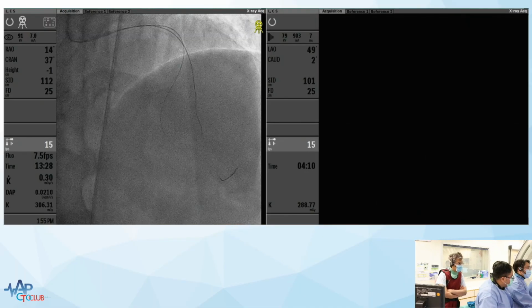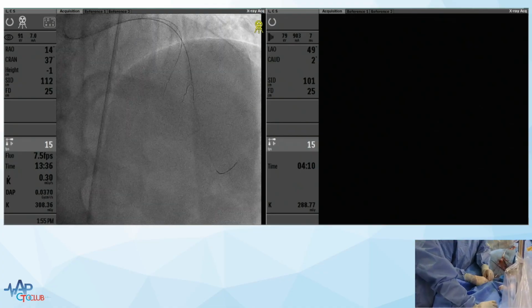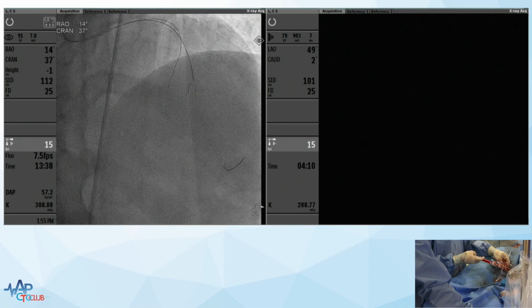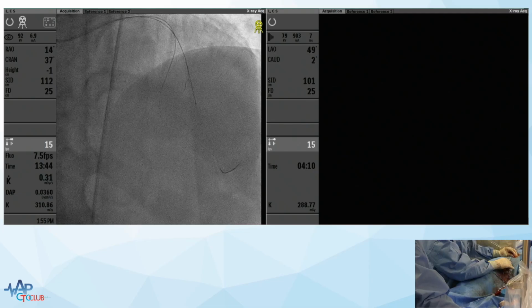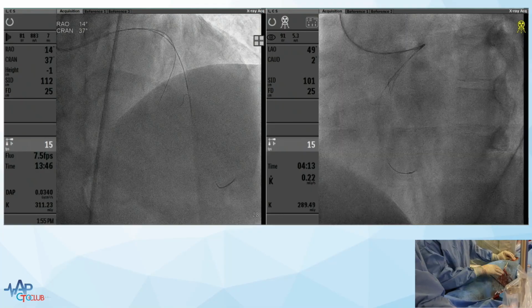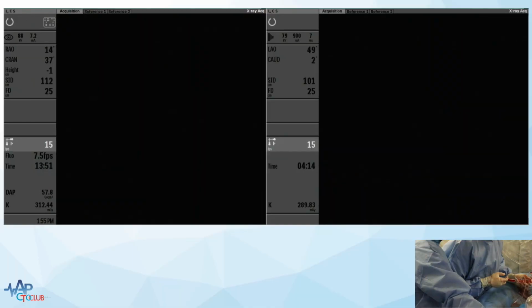But I think Karl has done it already, right? Yeah, not completely, but it's out of the curves. Okay, now we should check before we leave the septal. Just in case, we check for injury with the septal, and after that take out this septal system, and then put in a stent. Three steps. Sounds easy, right, Wataru? Cross the CTO, check the IVUS, put in a stent. Very easy.